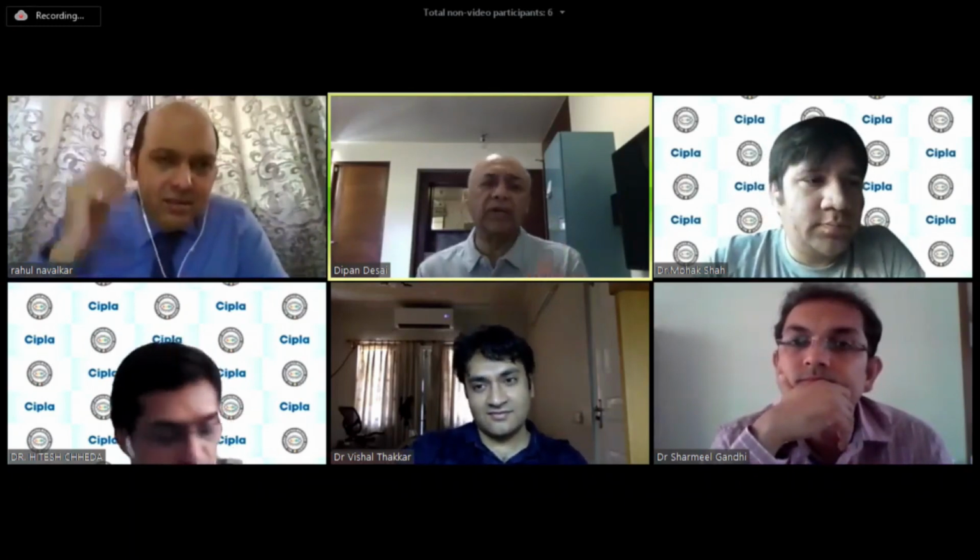Sir, a very important point I did not mention: up to 0.5 diopter cylinder is very forgiving. It helps all your multifocal, EDOF and trifocal patients for near and intermediate vision. So what I am now looking to correct is, let us say, a 0.5. I would definitely operate on the steeper axis.